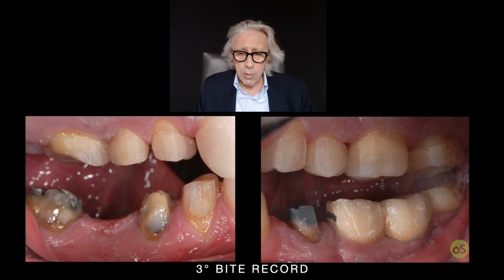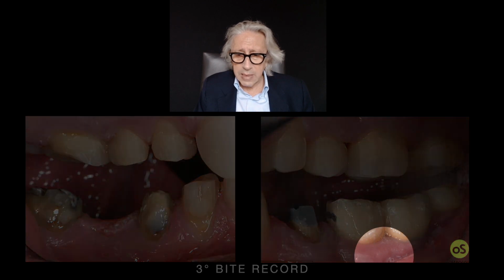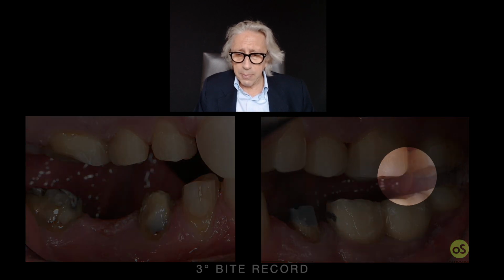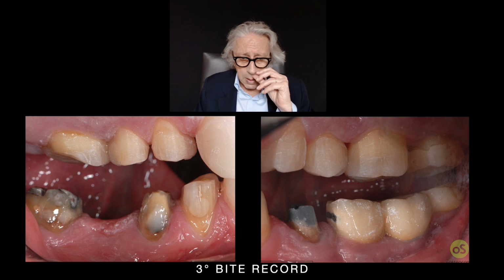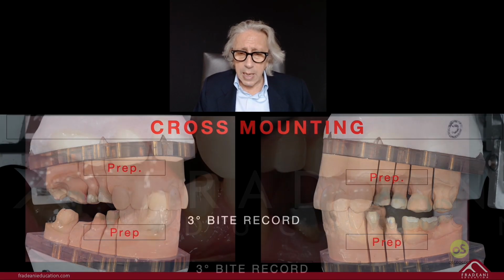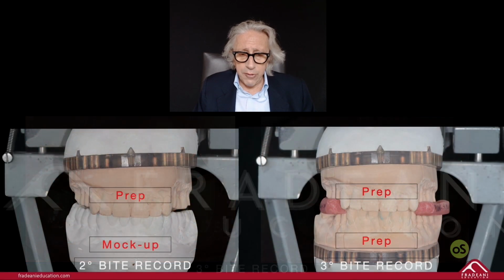So now we have the full space between upper and lower, because at this point we have the chance to create a lot of space between the 2 arches, having increased 6.3 millimeters, and we don't need, of course, to cut the teeth occlusally at all. We still have enamel, as you could see here, on the incisal part, on the cervical too, and occlusion. If you had enamel before, the enamel that you added, you kept, of course. But it was unfortunately not enamel 100%, it was just partially. Okay, so third bite record.